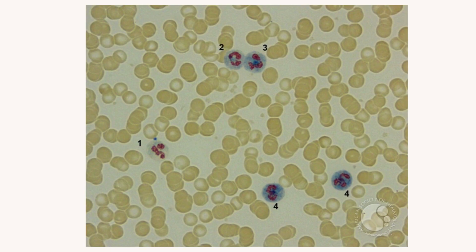So the air dried smears are fixed using citrate buffered acetone for 30 seconds, and this is then rinsed with running distilled water for 45 seconds. So do not allow the smears to dry. Afterwards, place smears in the staining solution for 30 minutes at room temperature.